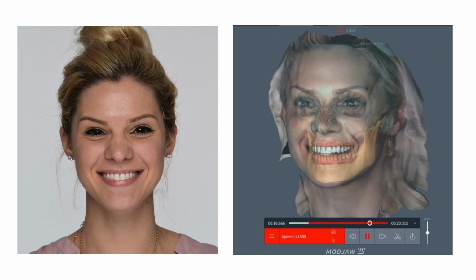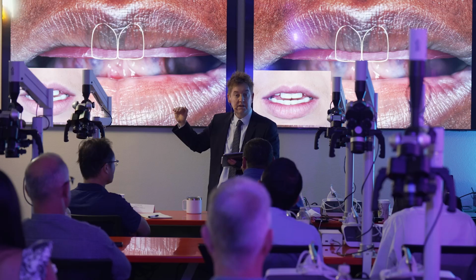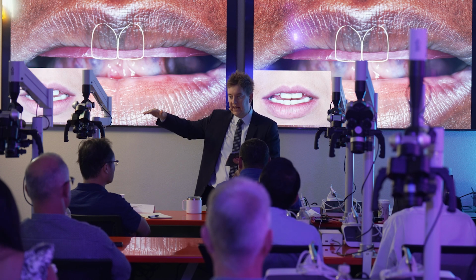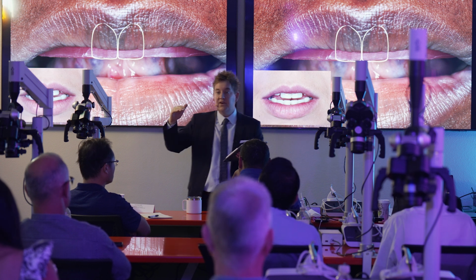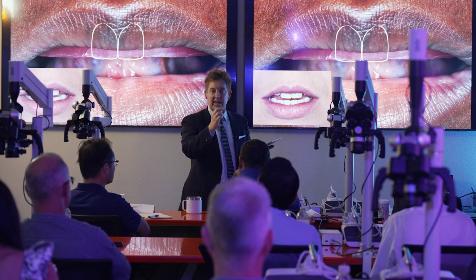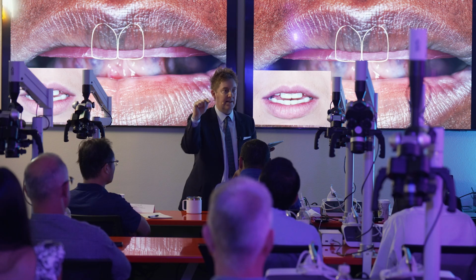Okay? So how do we like this 30-year-old's incisal edge position? That's right. It's right around 3 millimeters. So if we bring in our patient we're comparing to, so we set our centrals. Now, if we set our centrals on a wax rim and we set the incisal edge position right where we want in our treatment planning algorithm, and then the patient smiles and they show a lot of gum tissue, do we then intrude that tooth on the rim, or do we crown lengthen a little bit?